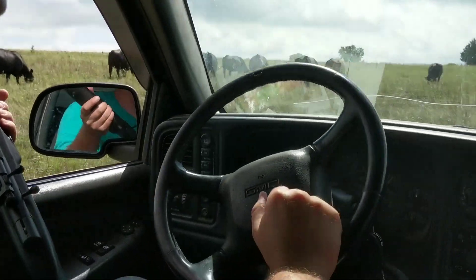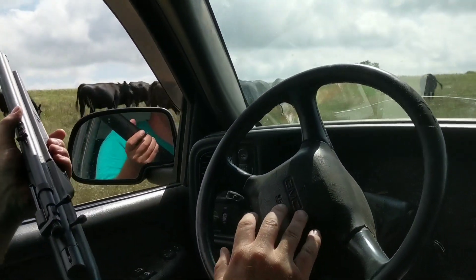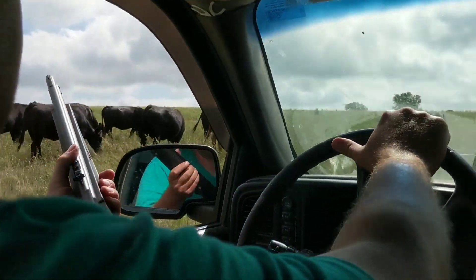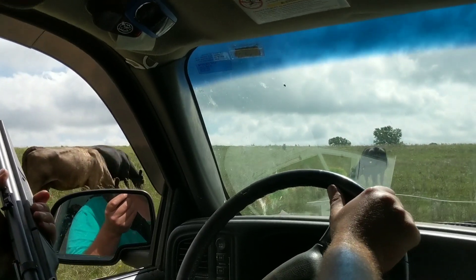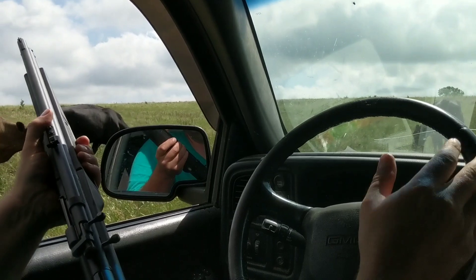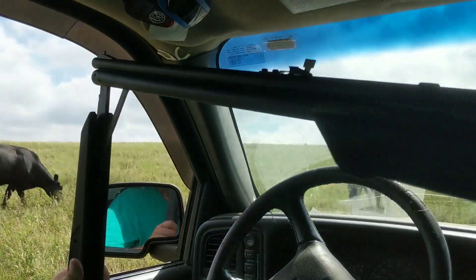The brown one? Yeah, the brown one. I'm gonna give you a chart for how many cc dart you're using and how far away you're judging you are, to how much you pump this thing up. I'm gonna go 4 pumps.